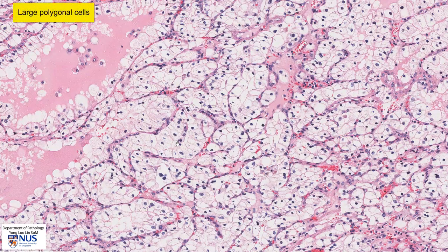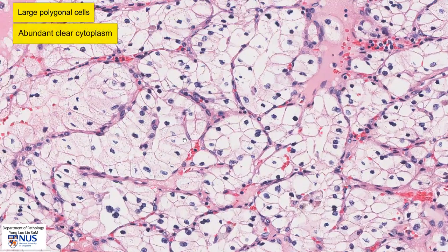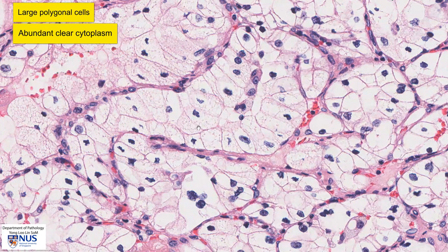These cells are polygonal in shape, they are large, and they contain abundant clear cytoplasm. At high magnification, we can appreciate that some of the cells appear to have an almost foamy or bubbly appearance in the cytoplasm. These cells appear clear because they are rich in lipid and glycogen, and lipid itself often washes off during our processing into microscopic slides.